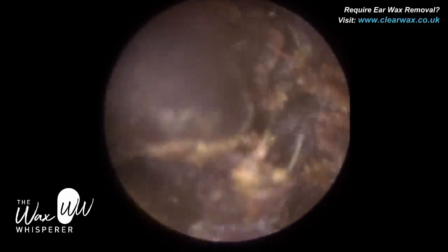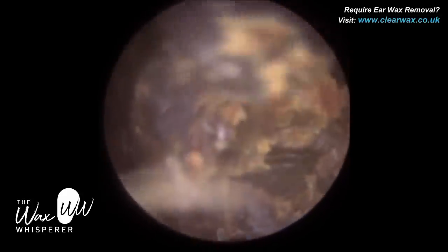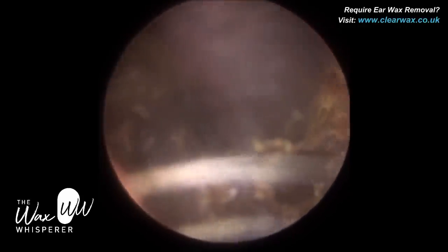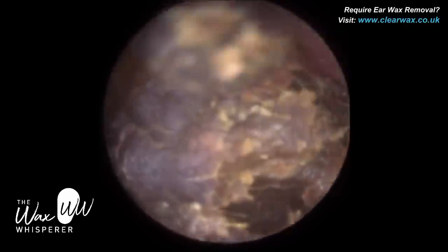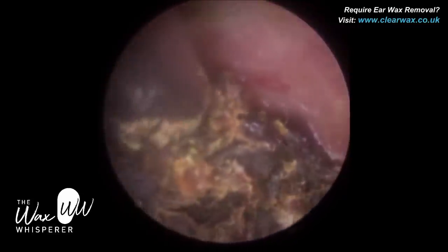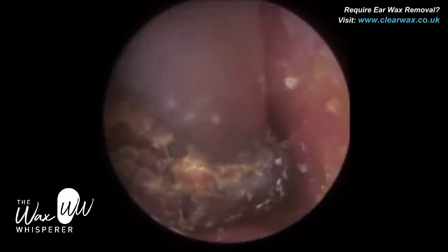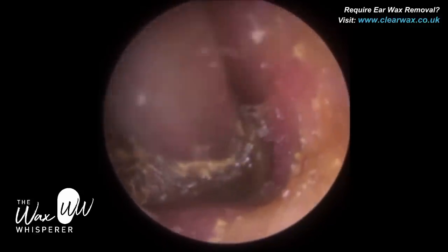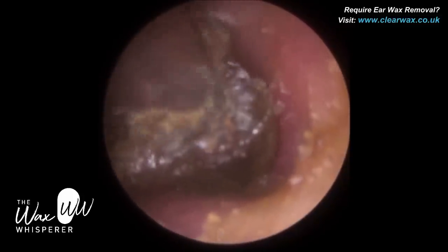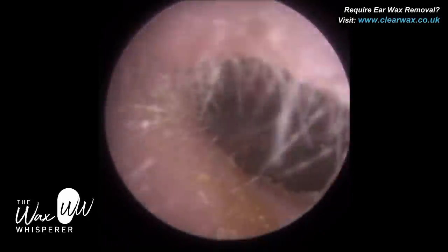In the UK, when they banned ear syringing, they replaced it with ear irrigation. It's a similar concept — using water flushed into the ear canal so it hits the eardrum and bounces back out, flushing out any wax. But the difference with an ear irrigation machine is it's like a water pump where you can control the pressure, either electronically or using a manual foot pump. Interestingly, it all stemmed from dentistry — a dental nurse suggested using what's used to irrigate the mouth during dental procedures. A nurse actually developed that concept, so the first ear irrigation machine was essentially a dental irrigation machine.